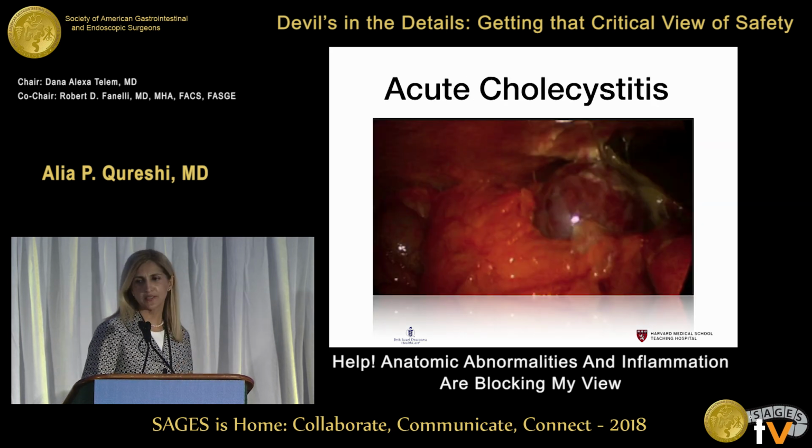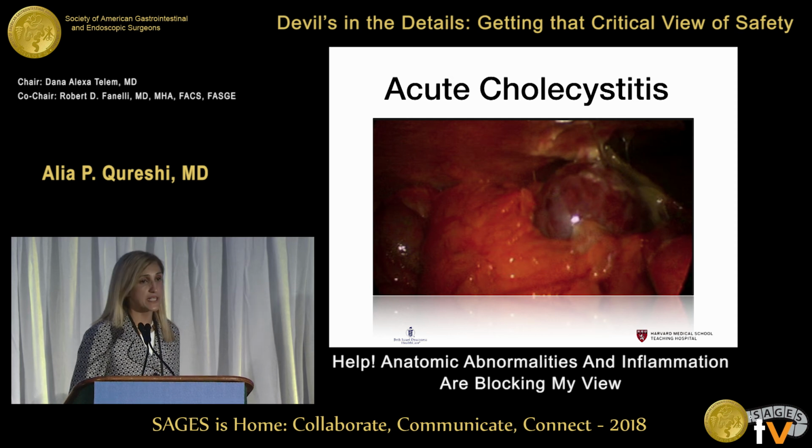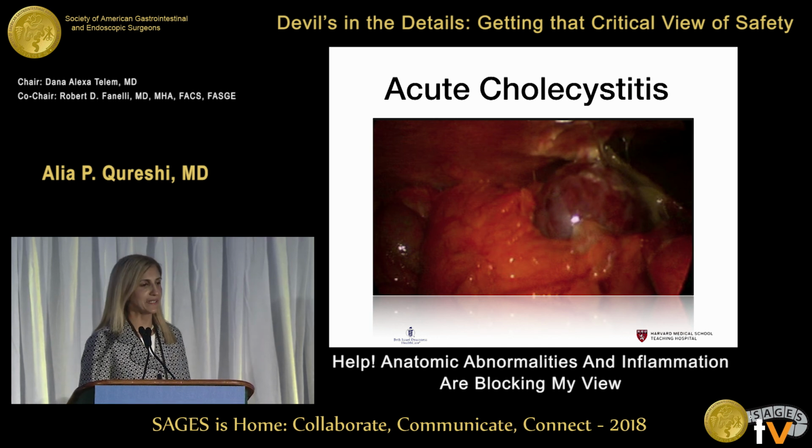So I'm not sure if this projects very well. This is an 80-year-old female presented with acute cholecystitis 2 days before I came here. It was a very difficult dissection. Surprisingly, her ultrasound was not very impressive, so I figured I could get this done and then go off to my meeting. It was quite the challenge.